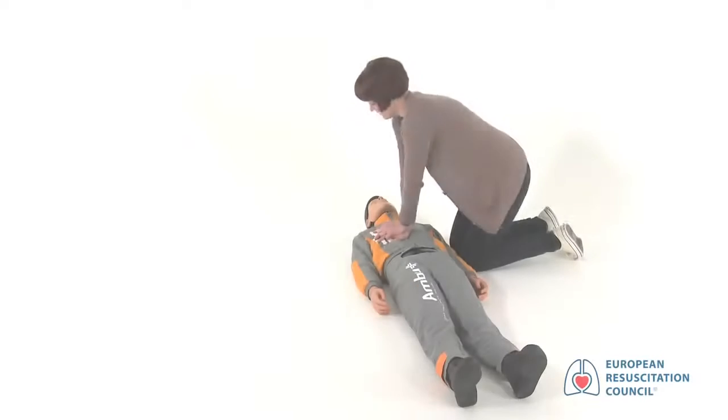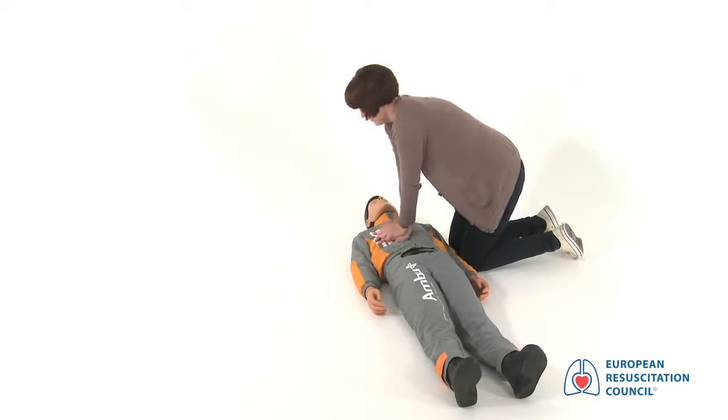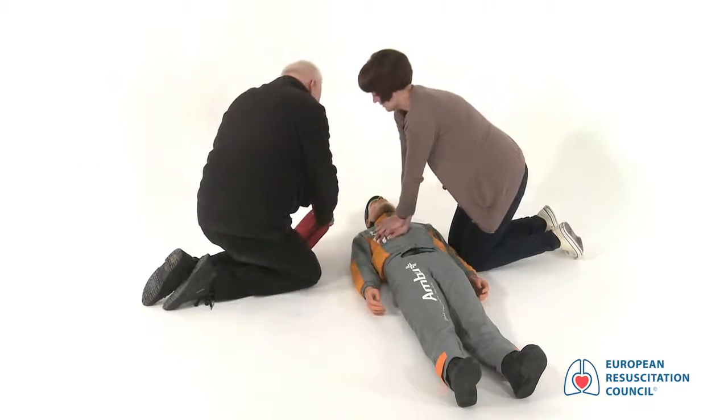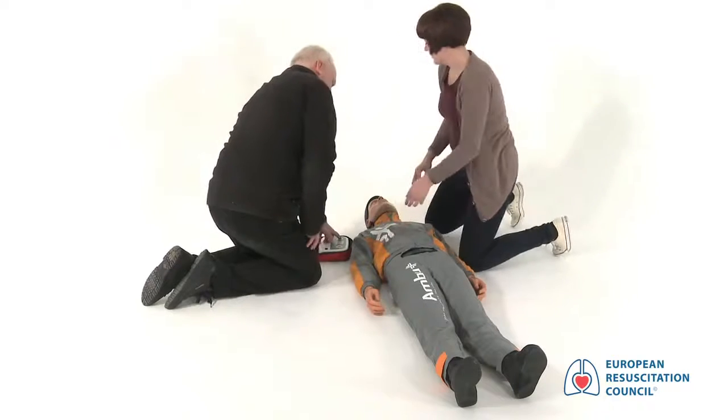If circumstances allow for a second person to assist, then the skills should be split between the two rescuers. The first person should continue CPR until prompted to stop. Go on, I'll work around you. The second person should operate the AED following the voice prompts given.